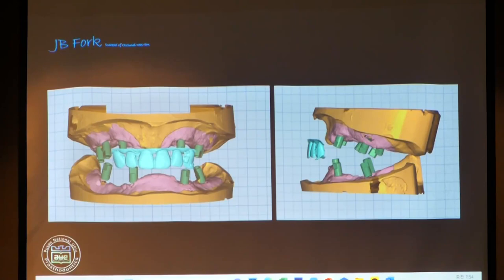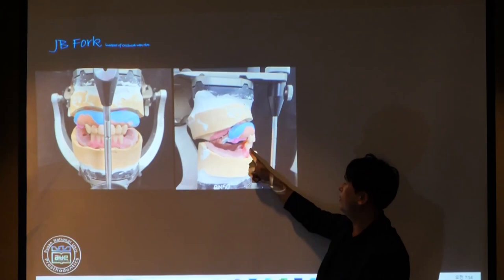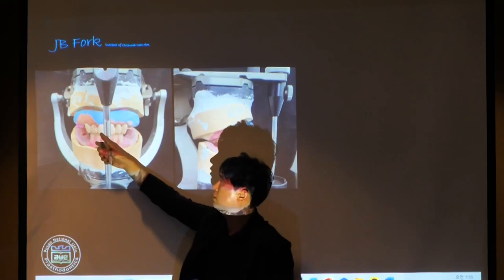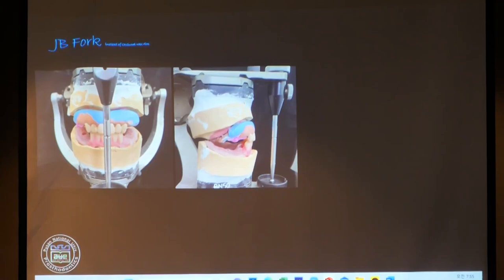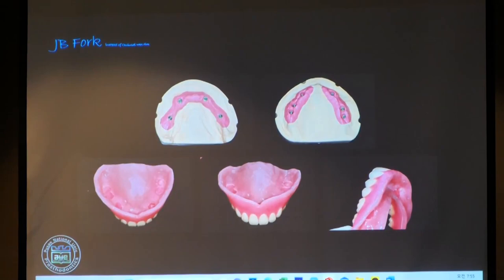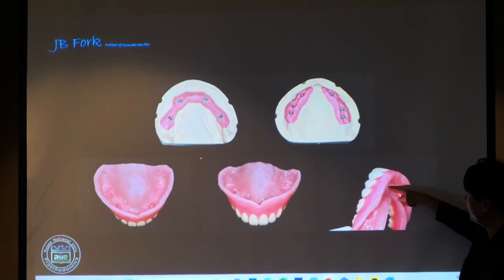So, and then I separate the upper and lower plate, and I position the upper one, and then I arrange the lower anterior teeth directly. But according to the patient, the width or the size of the anterior teeth will be different. But this patient is proper for him, I'm sorry. So I choose the artificial teeth of the same size as the JB fork anterior teeth. And then I finish the arrangement. Then, so I'm so happy because I didn't use the occlusal wax rim. So these two, you can compare between the remaining alveolar ridge and the anterior teeth.